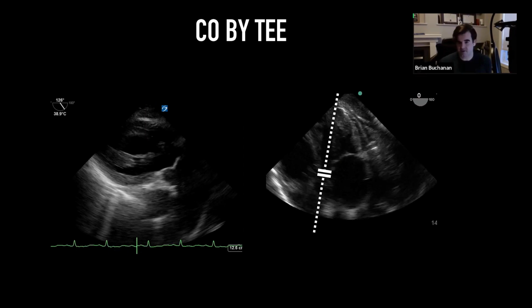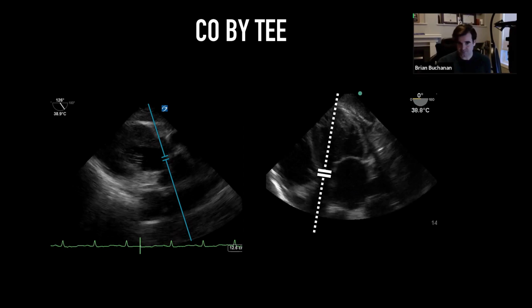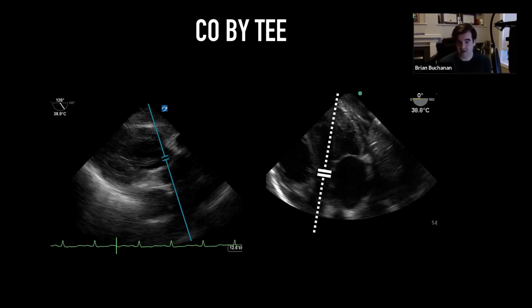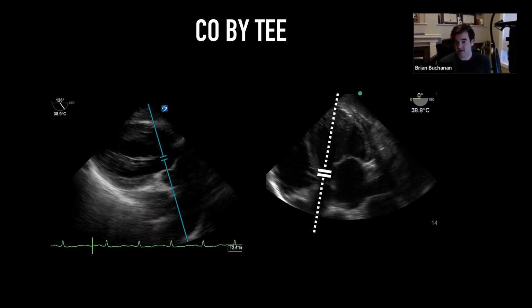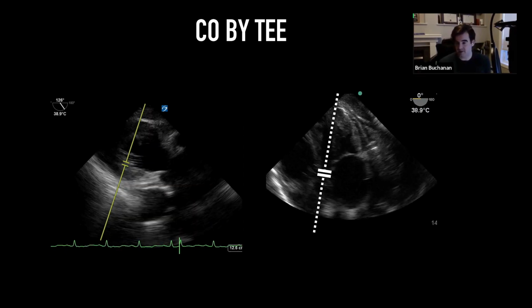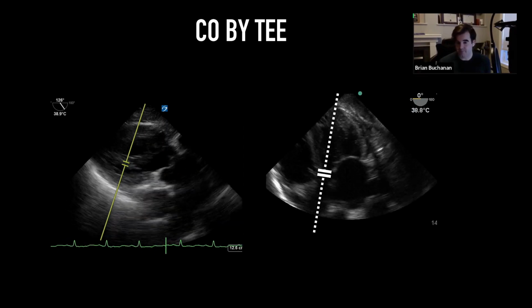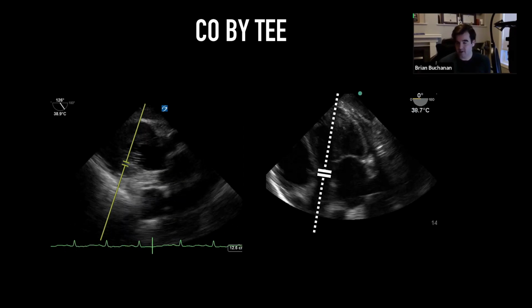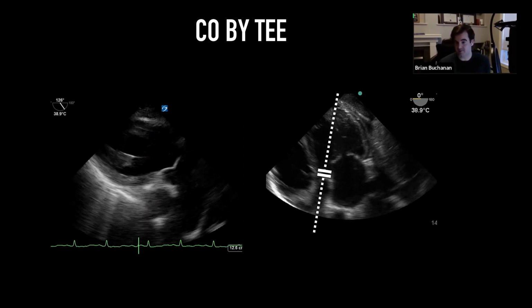Certainly with transesophageal echo, we can use other views shown here. On image left, we have a transgastric long axis with the outflow tract around 5 o'clock, and this angle will occasionally offer a very helpful angle of intercept for that flow. On the right, we have our deep transgastric view, where the angle is very, very strong for interrogating that flow.